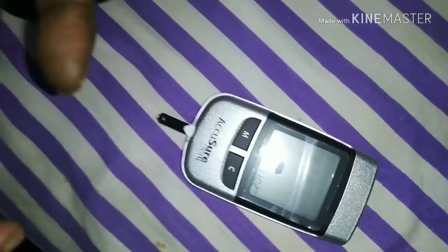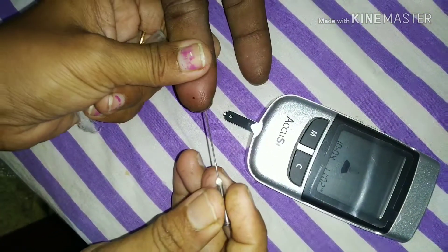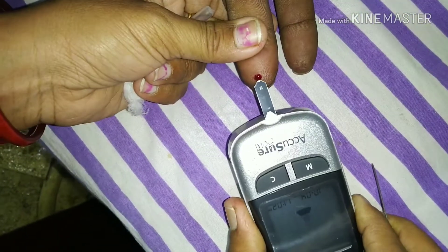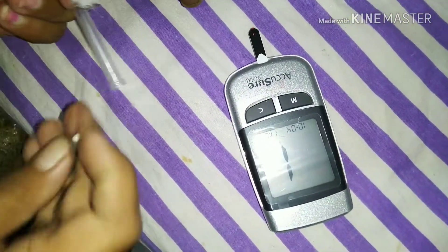The machine will be ready and you can see the blood drop indicator. Now prick your finger — a pinch of blood will flow. Just touch the blood to the circuit and after five seconds it will show you the result.